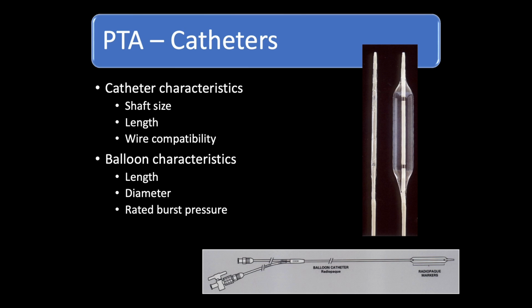So here you have a PTA balloon, where the PTA balloon is usually a double channel tube. One channel is connected to the balloon lumen, the second channel is connected to the central lumen. By using the balloon channel, you can inflate the balloon or deflate the balloon. Here you have a radiopaque marker to identify. These are all non-radiopaque materials, polyethylene, so you will not be able to see. So this radiopaque marker will make it visible, showing the extent of the balloon.